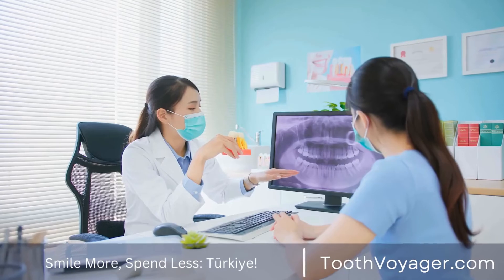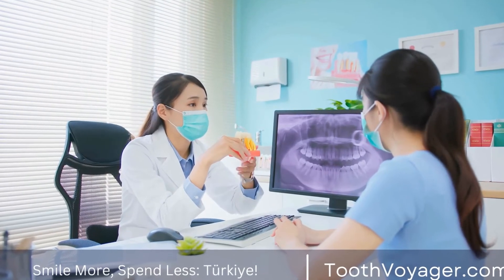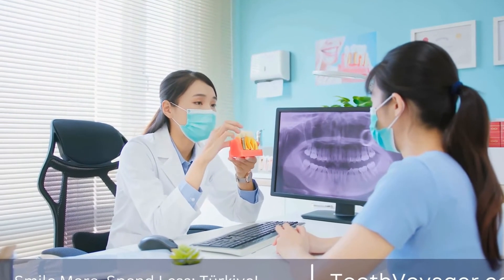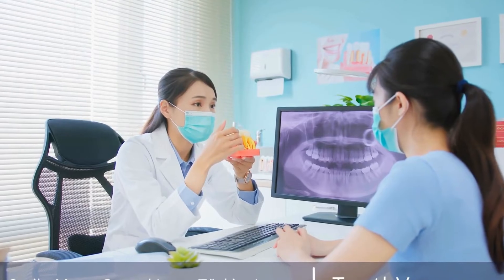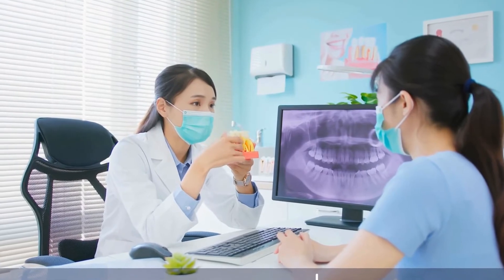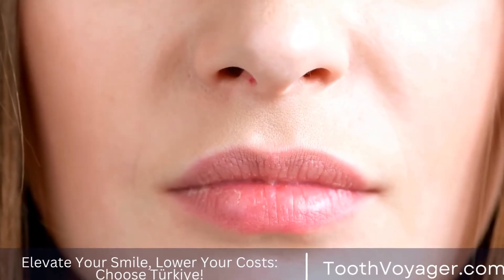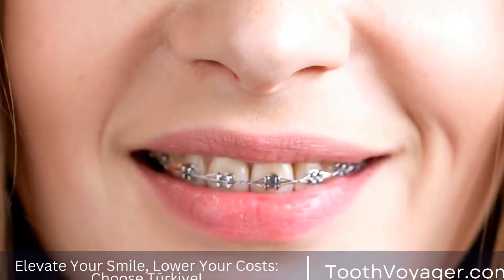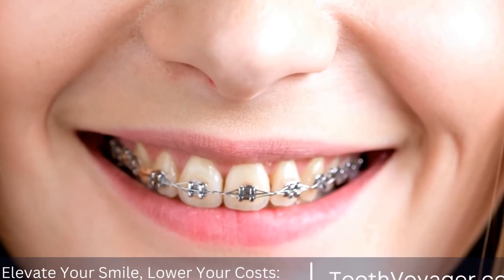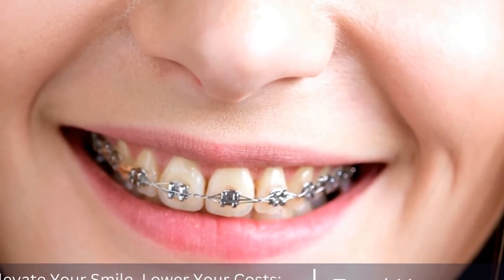Your dentist will start by taking an x-ray of the affected tooth to determine the extent of the infection and whether a root canal is necessary. Once the diagnosis is confirmed, your dentist will discuss the treatment plan with you and answer any questions you may have.